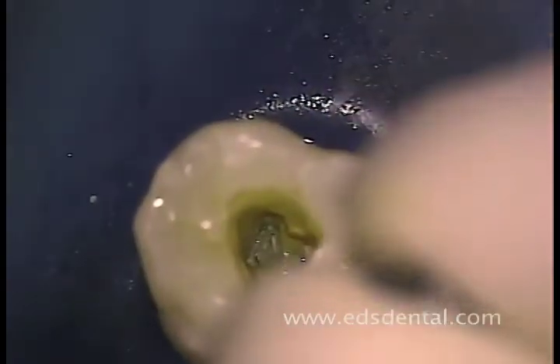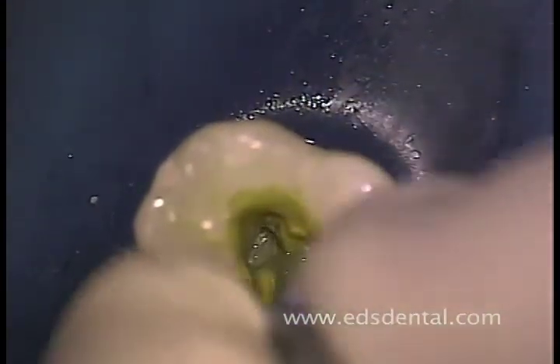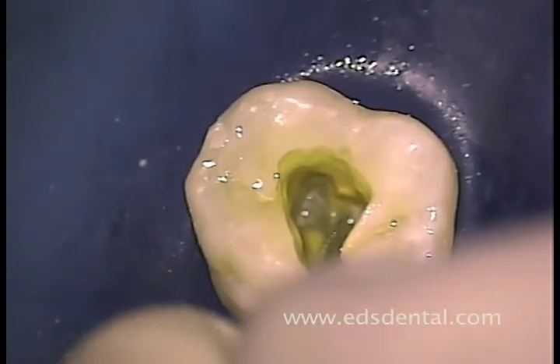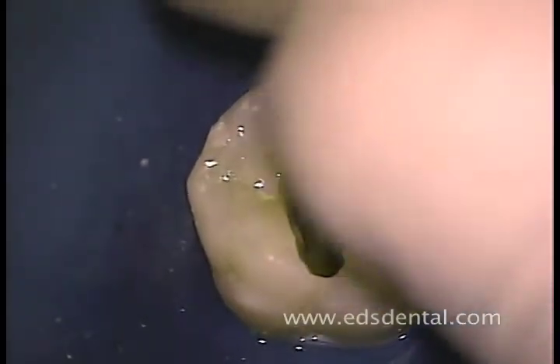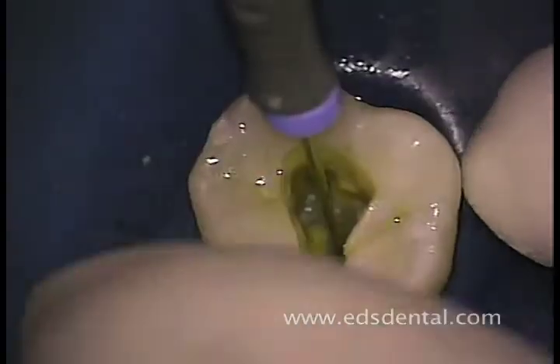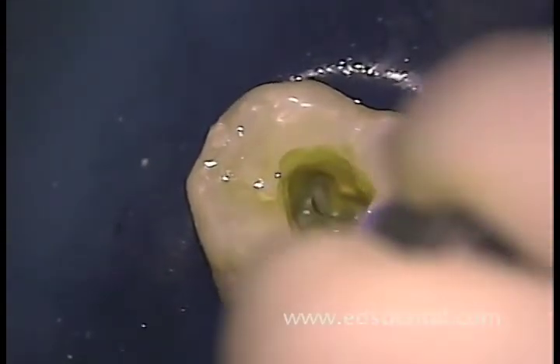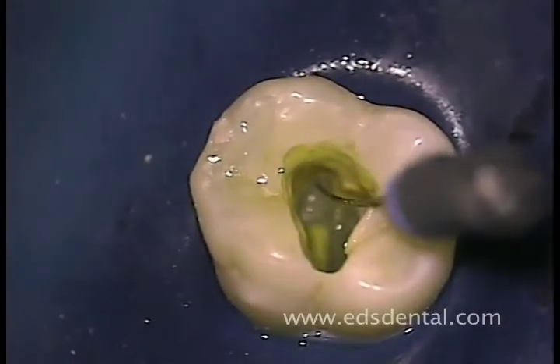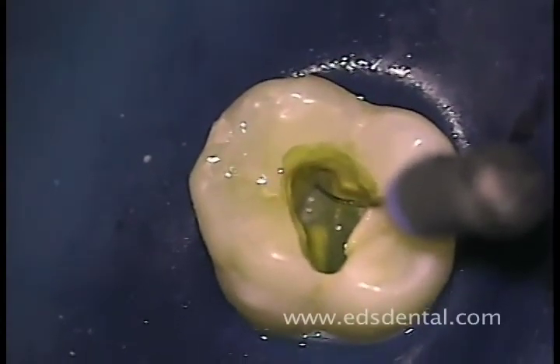To sum up, the ability to recognize the roof of the pulp chamber and then completely remove it gives us a full view of the floor, giving us a greater opportunity to remove any degenerative calcific structures we encounter — in this case a large pulp stone and overlying dentin, particularly in the mesial buccal portion of the floor. Excellent illumination and magnification make this possible. With clear vision, the procedural stress is minimized because we know exactly where we have to go and how to get there. Please don't always expect to find an MB1, MB2, and MB3, but be prepared to look for them under relaxed conditions.